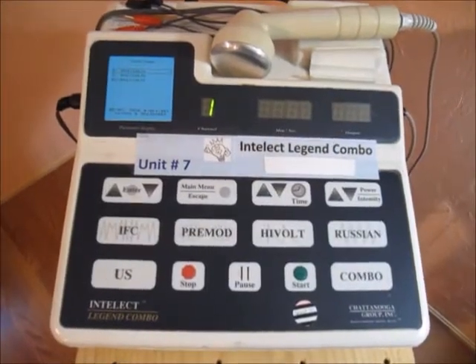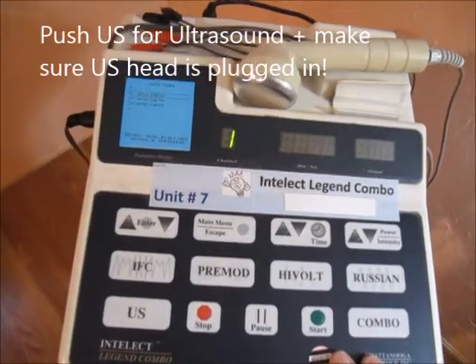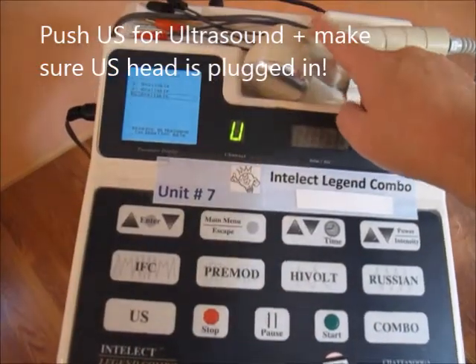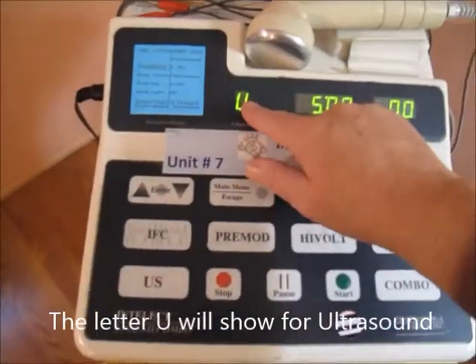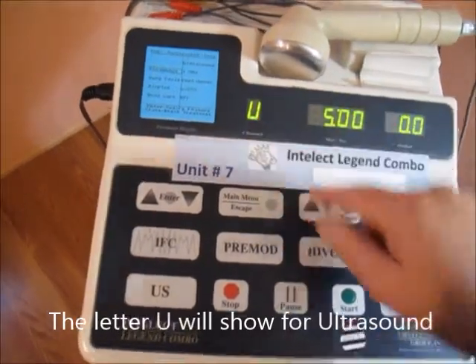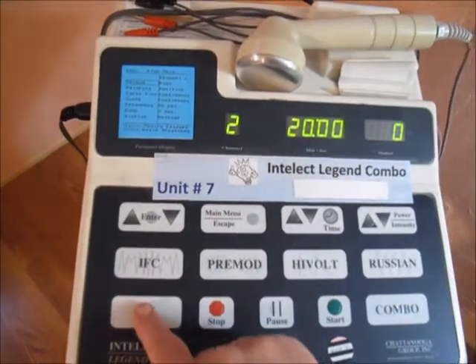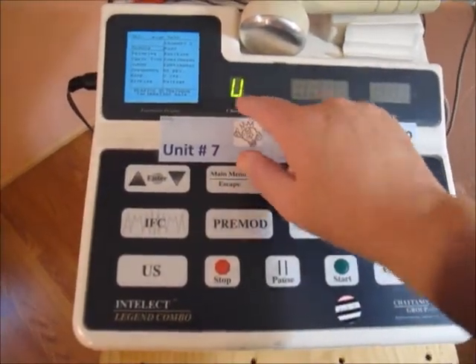To use this machine for ultrasound, you quite simply push the ultrasound button. Make sure the ultrasound head is plugged in. Notice this little dial switches to a U. If I switch to something like high volt, it switches to a 2, but if I put ultrasound in, you'll see a U.